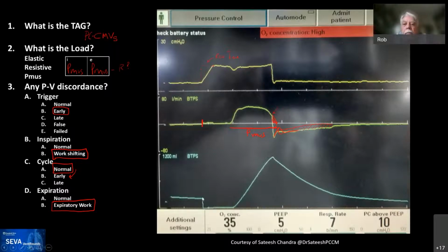Yes, the thing that I kept vacillating between those two was that the volume kept changing. Well, the volume is almost flat though. Again, it's probably a scale problem. Exactly. But I mean, he was coming from 1200 cc's. He's not exhaling as much volume as he inhaled. Yeah. So it appears that it's almost a flat line on the volume, which would give you a zero flow, right?